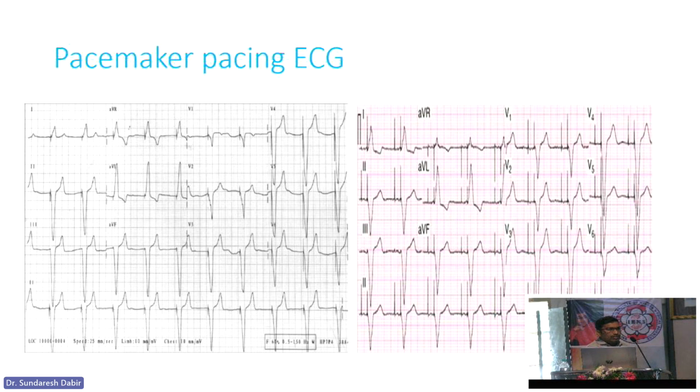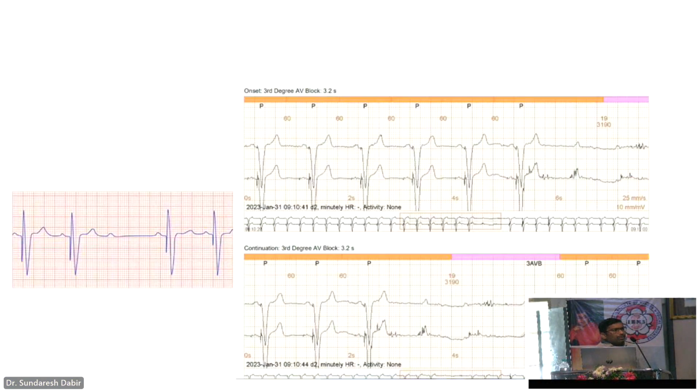So here it's a question for you. What is this? If somebody can tell me what pacemaker this is, single chamber or dual chamber, and why there is some gap here, I'd very much appreciate it. Is this single chamber or dual chamber, by looking at these intervals? Anyone, one person, take it up. Quickly.